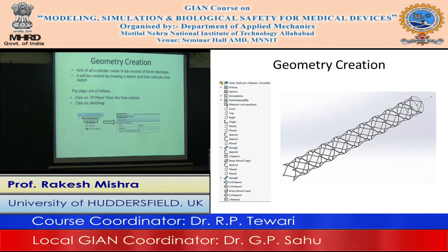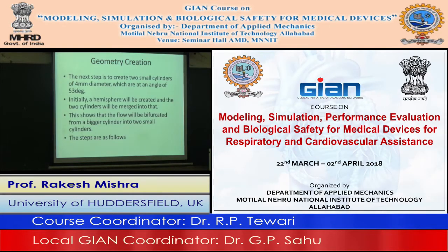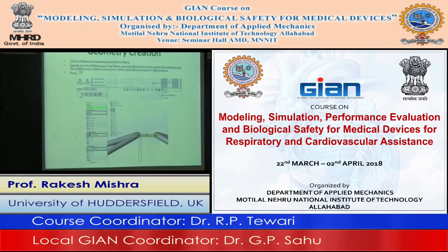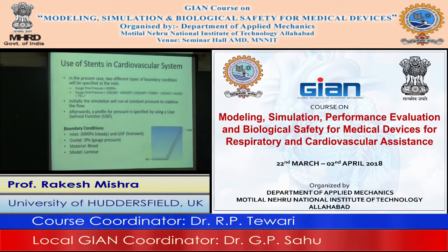So we create XY plane, and on XY plane we create a circle which we extrude along the X direction, like you did all yesterday. Although we created from primitive, we created cylinder like this. Once we created a cylinder, we want to create... so main thing is here we are creating we have that thing.